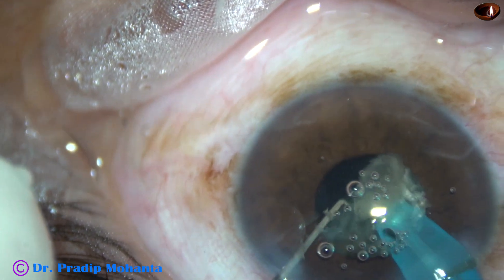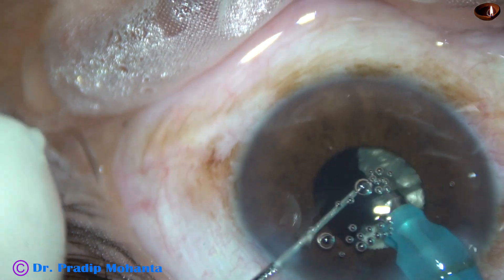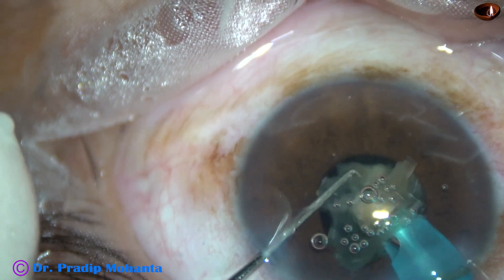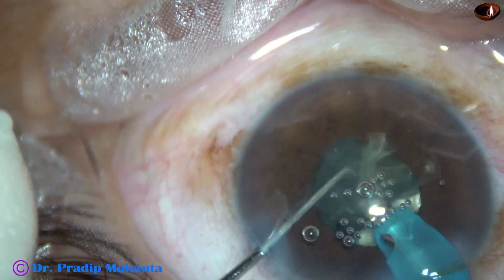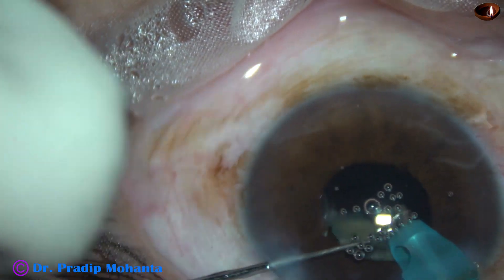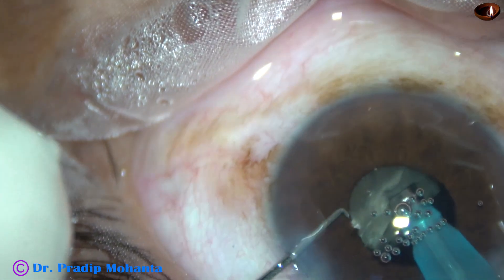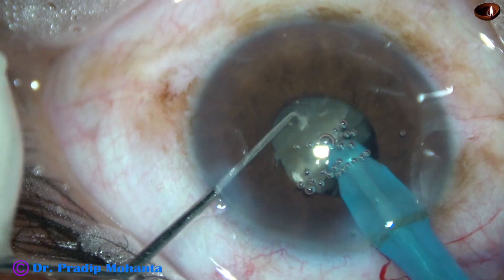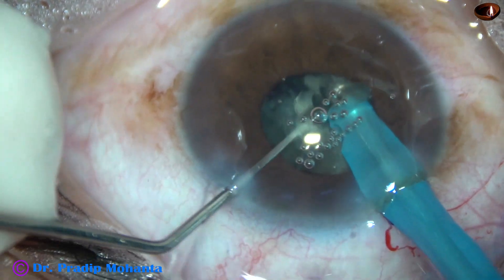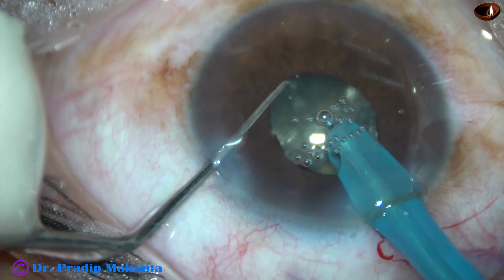I am always at the iris plane, and the tip of the phaco needle is always at the center of the pupil. And this is the third piece of the hemi-nucleus — it is done. Now I rotate the other hemi-nucleus and bring it in front of the phaco teeth and chop it into two pieces. But these two pieces are not completely separate from each other; they are attached near the center.